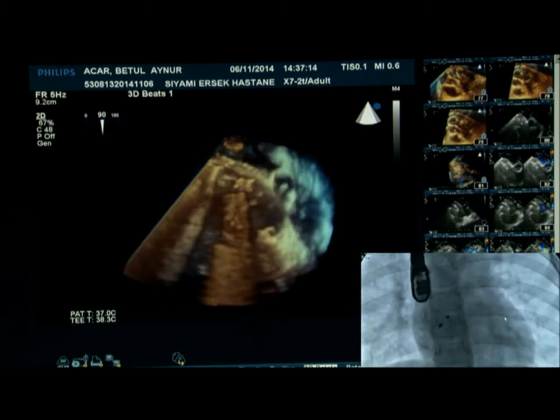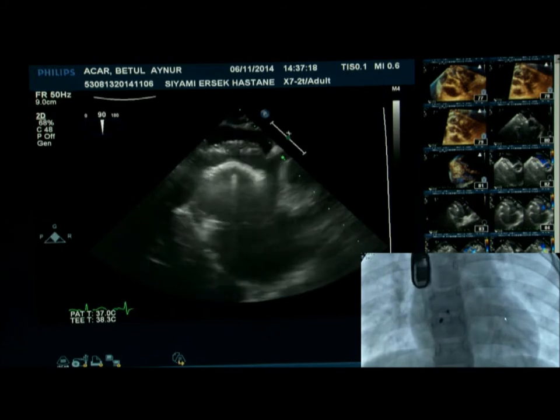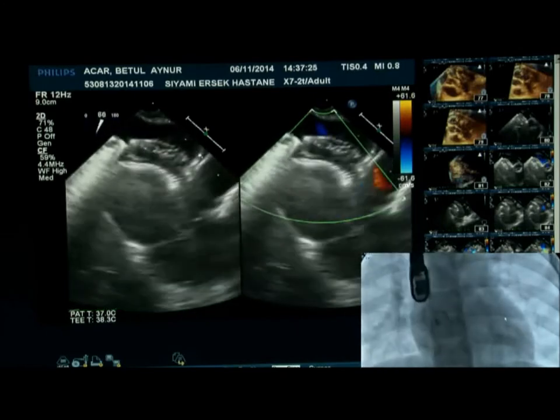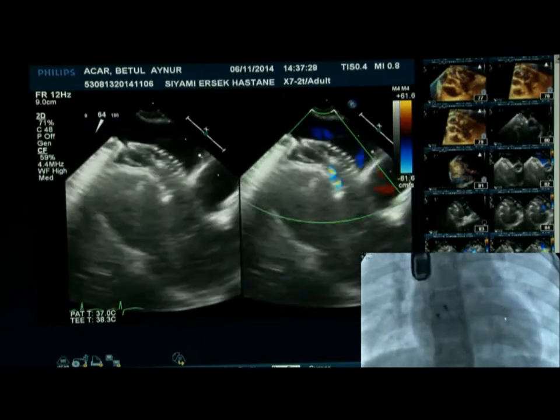There's one more question from the audience. Yeah, the point I was going to make was that on color, there's very little flow. We seem to have covered the other little holes. There's a little bit of flow, well, not even that now, between the two discs, and that will eventually go. So go ahead with your question.